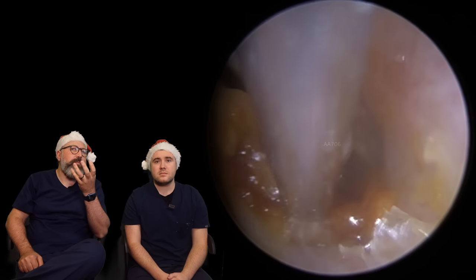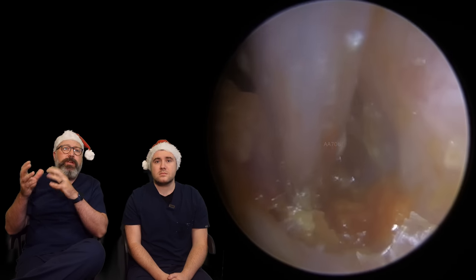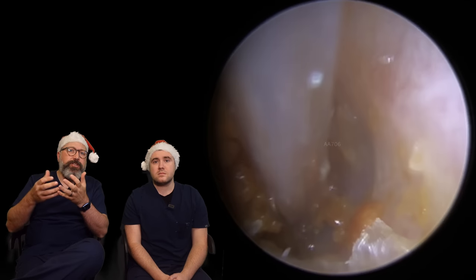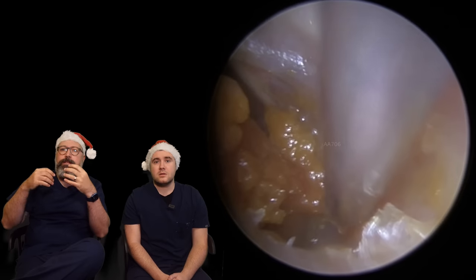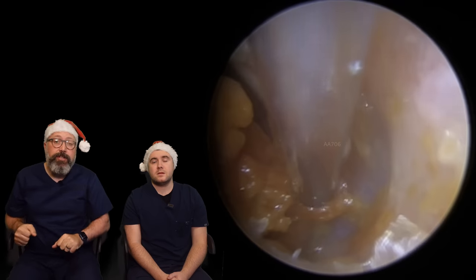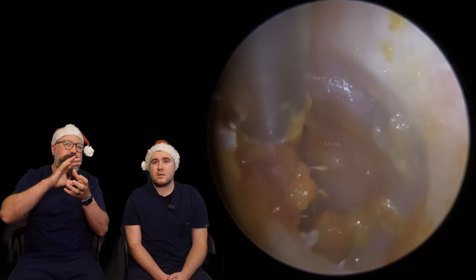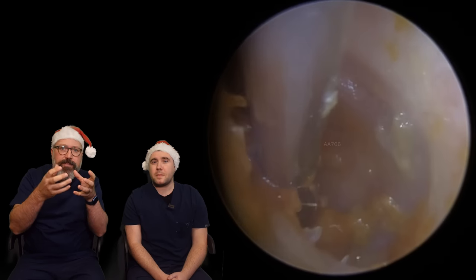With these types, when wax looks very soft, squishy, runny, it tends to be that the patient's used a more aggressive wax softener — something along the lines of a peroxide or bicarbonate drop. When we talk about the difference between irrigation and microsuction, a lot of people come in from the US and mention that many audiologists over there carry out irrigation and it's very difficult to find someone that does microsuction like we do here in the UK. The preparation is very, very different. If you're preparing somebody for irrigation, you want that wax soft and squishy — so a really aggressive drop is helpful. But for microsuction, you want to keep the substance of the wax and just soften the outside edge, so we prefer an olive oil drop.